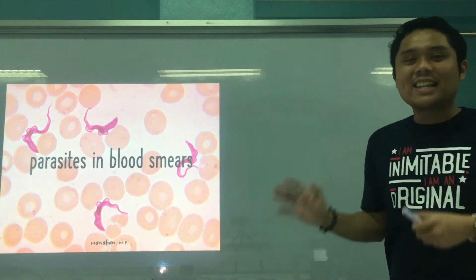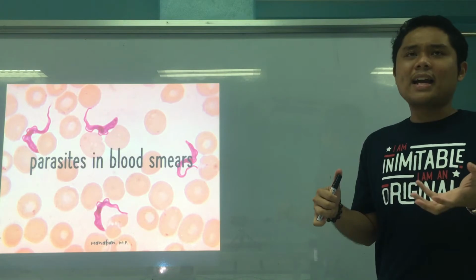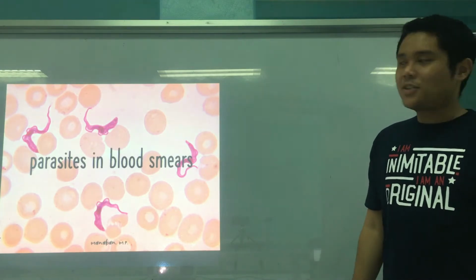Anyway, alright, so again, these are your parasites in blood smears. Maybe it's too much information, but I would expect that this is a review now because you're done already with this in your lecture. So, parasites in your blood smears.